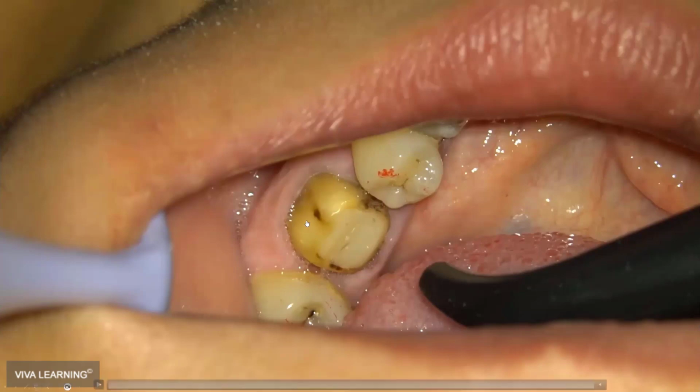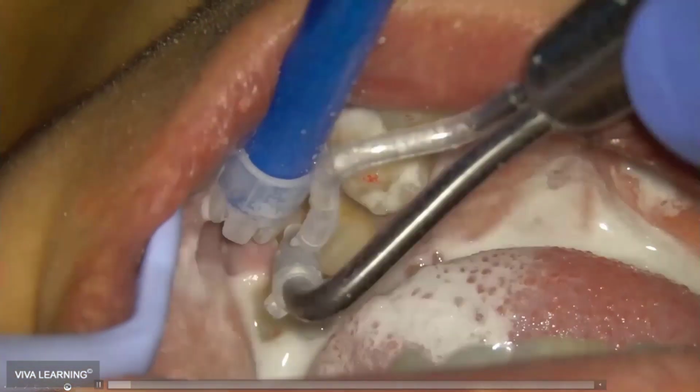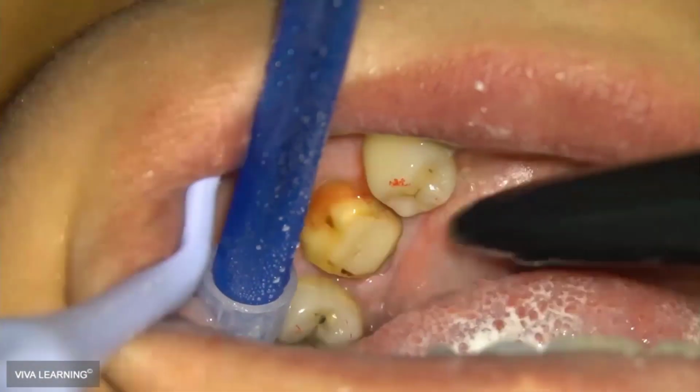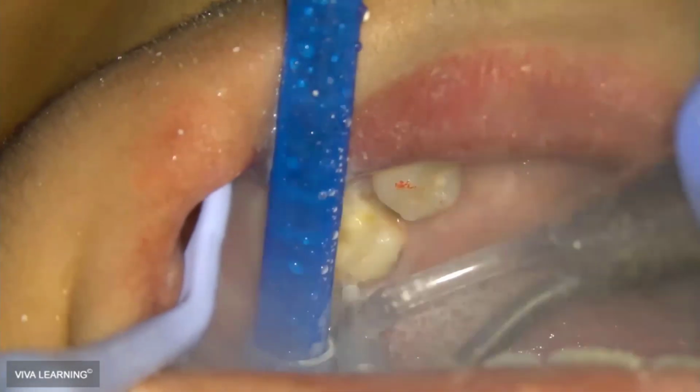The first thing you want to do is to clean the preparation before cementation. Doesn't matter if you are using a prophy paste or an intraoral sandblaster. I will definitely recommend the intraoral sandblaster because it's doing a better job on cleaning the preparation. But take a closer look in here. We start to clean the preparation. We are using the intraoral sandblaster, and every time you want to clean it and clean it well, you'll have bleeding. This is the rule.